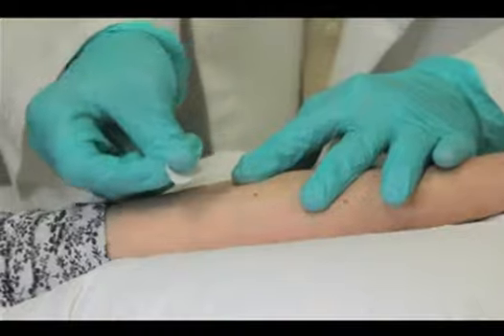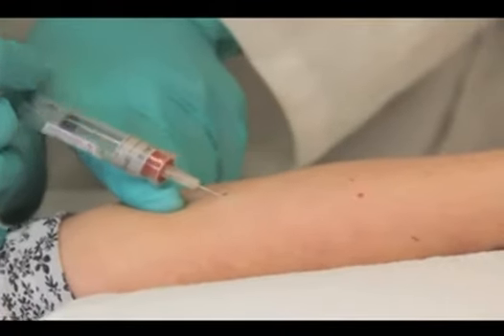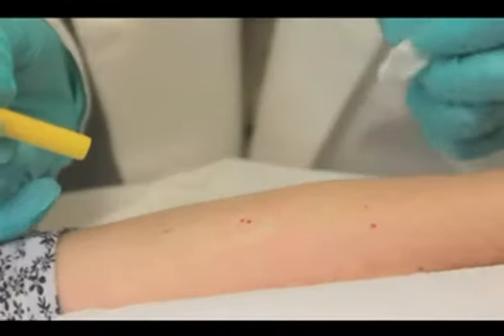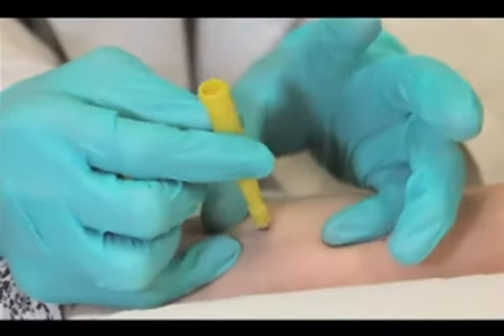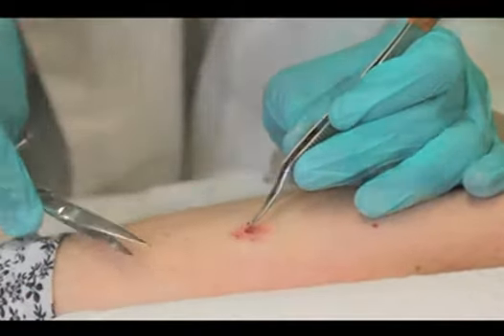The punch biopsy is a diagnostic tool that allows for histologic examination of skin conditions. We will first provide an overview of this procedure, followed by the indications and contraindications for the performance of a punch biopsy. We will then provide a step-by-step explanation and demonstration of a safe technique.